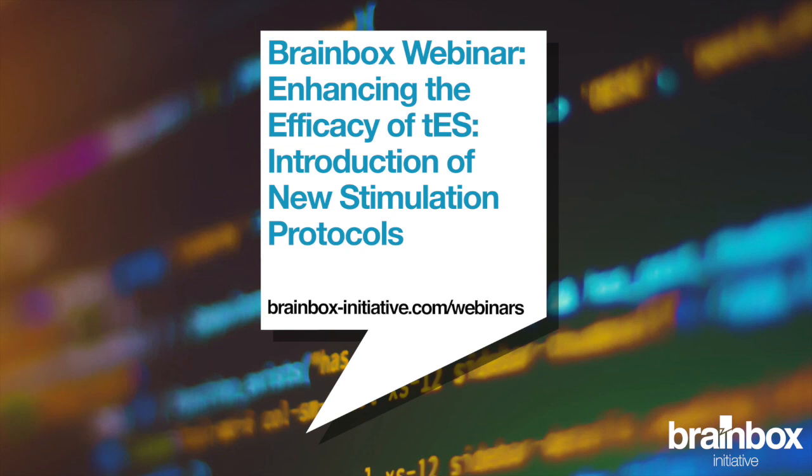Maybe if I could put things together a bit, I think the results we had are actually not so complex. They show first that for anodal tDCS, with the whole range of intensities and durations we tested, we had uniform effects at the group level in the direction of excitability enhancement. Cathodal tDCS is a bit more complex, because we have this enhancement with medium intensity, which is physiologically based, but with different intensities we also have excitability diminishing effects. So for cathodal tDCS, it might be more important not to overstimulate.